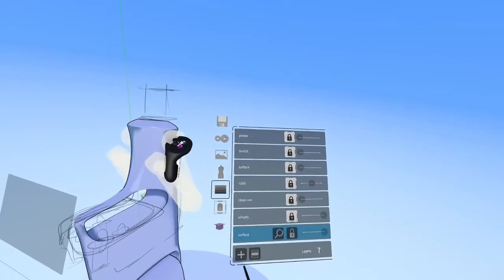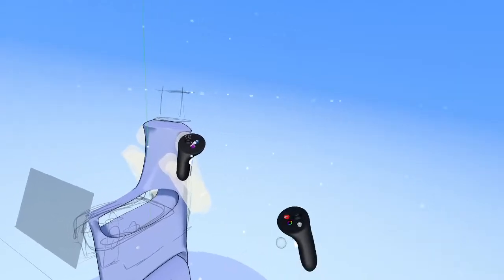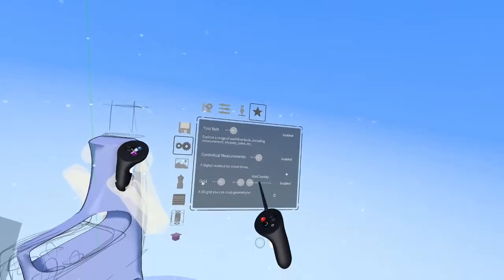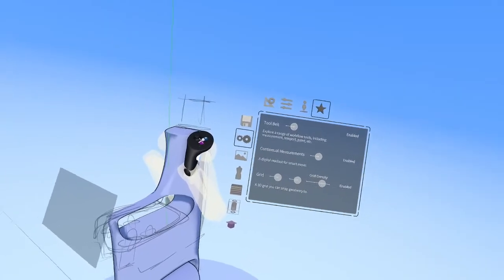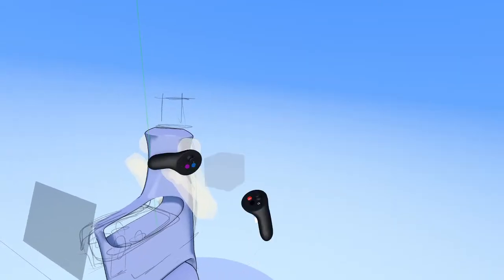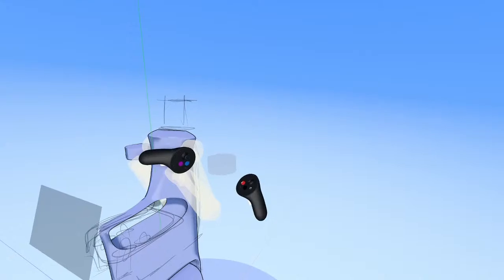Turn the grid on here. And actually, the grid's pretty spaced out right now, so I'm going to adjust the density so it's a little finer. Let's go for 5 centimeters. And then come here to primitive shapes. Drop in a shape, not a cube, but a cylinder.